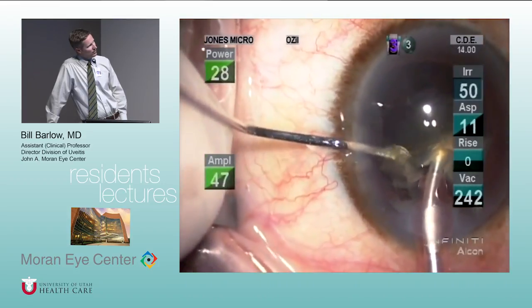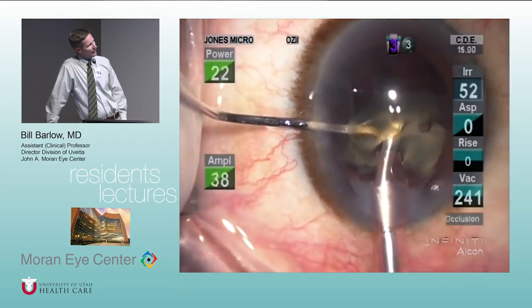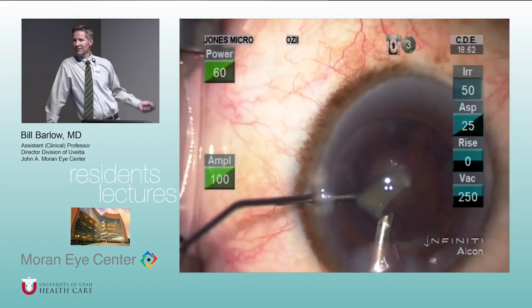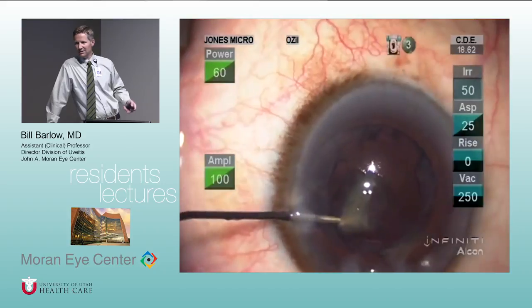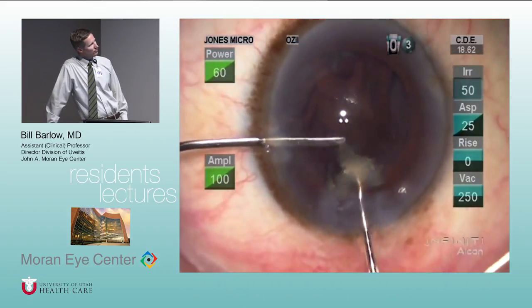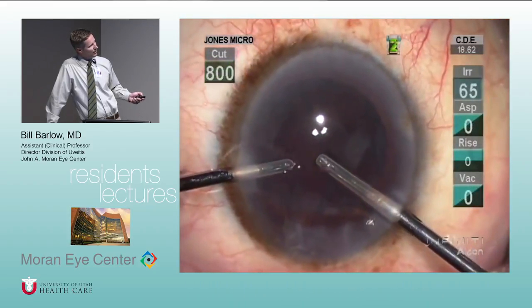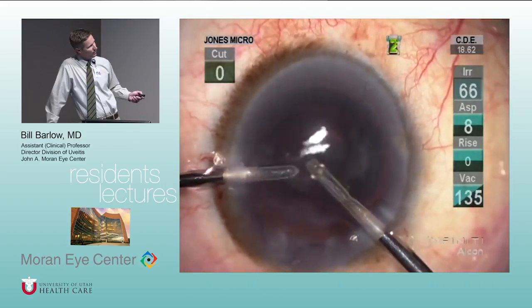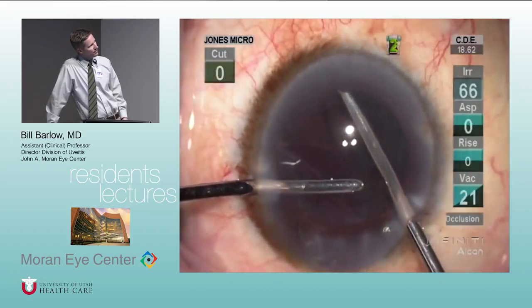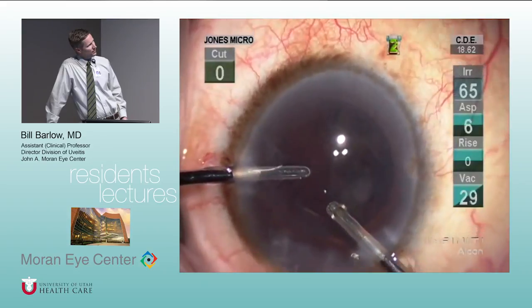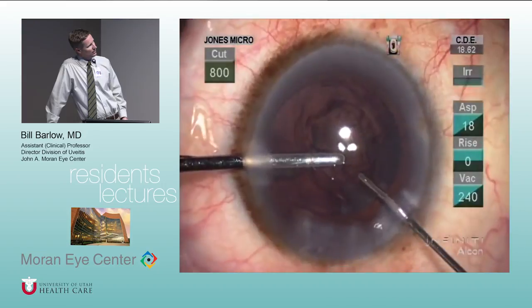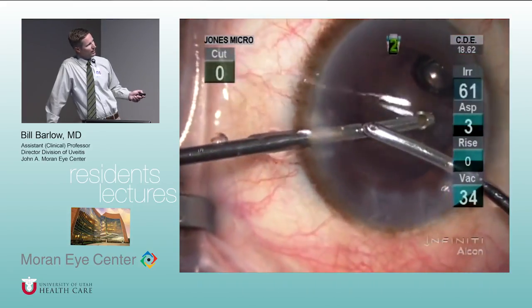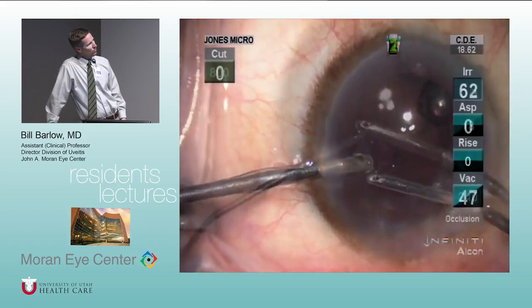He goes back in to remove the lens material — possibly injecting a little viscoelastic behind it as he removes it. There are multiple edits in the video as he goes back and forth between viscoelastic and the phaco handpiece. He then manually removes the small final piece. He uses bimanual vitrectomy instrumentation — you can see he controls the irrigation, keeps it directed anteriorly, and uses the vitrector to remove cortex by switching from cut-IA to IA-cut setting, aspirating the cortex safely.